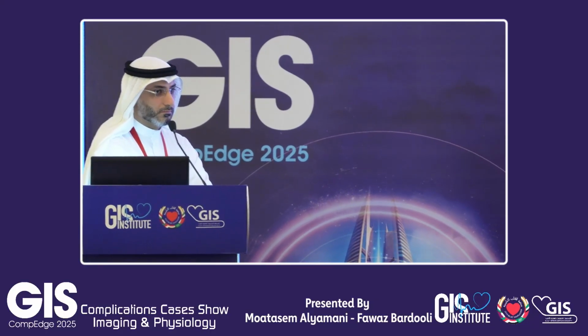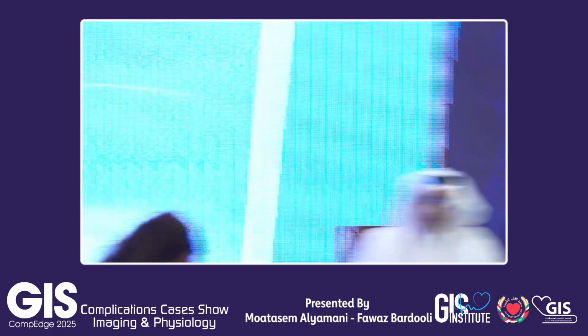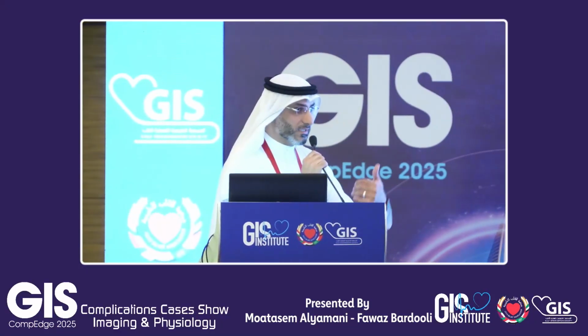But from the start, the FFR is 0.7. So the LIMA will be very happy dancing on this LAD, because it is already before dealing with this LAD. I mean, not in this particular case, but just in a borderline left main lesion, sometimes you rely on IVUS and you send the patient to surgery, and they are worse after surgery. So you have to prove it. At least physiology should be there on board to prove that this is really ischemic. Because in this case, if you send this patient to surgery, I think the venous graft to the circ most likely will occlude. Agree. And I think also if you do the iFR in the circ, it will still not give you a very accurate assessment in the beginning.